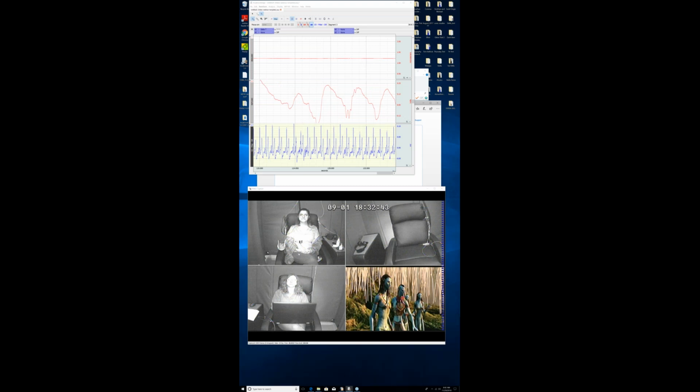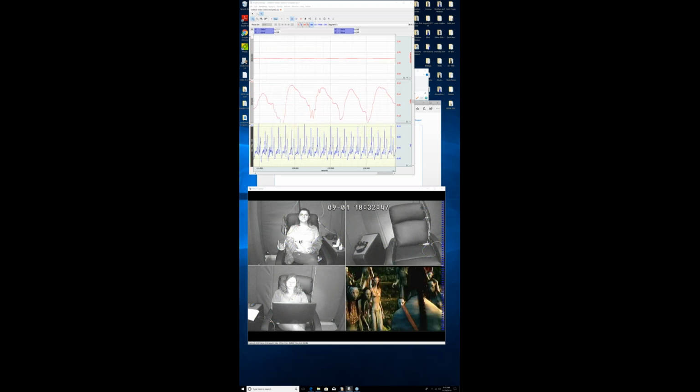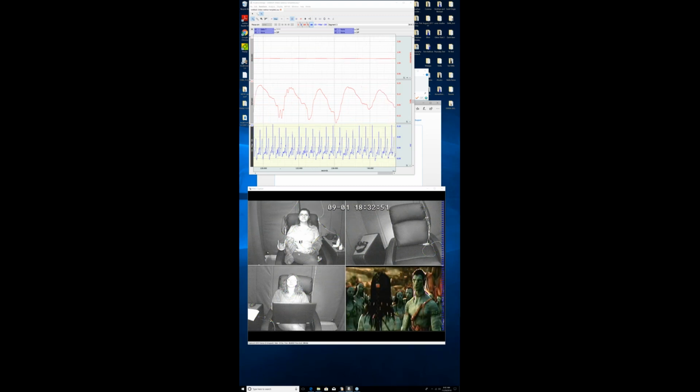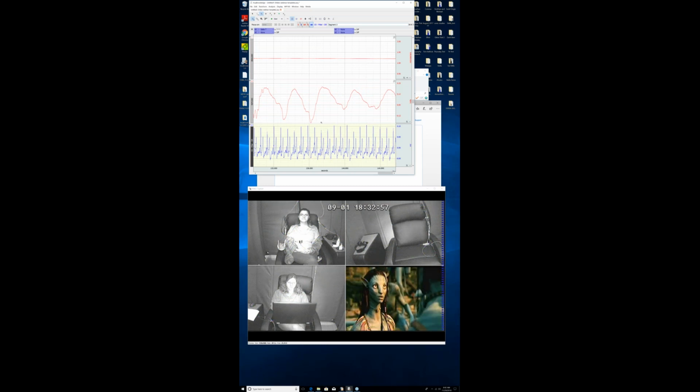So pretty easy to set it up. The same synchronization applies. If I come over and hit stop, you'll notice that the footprint has changed, because I'm actually using a portrait style monitor. Normally we've got two monitors set up here.